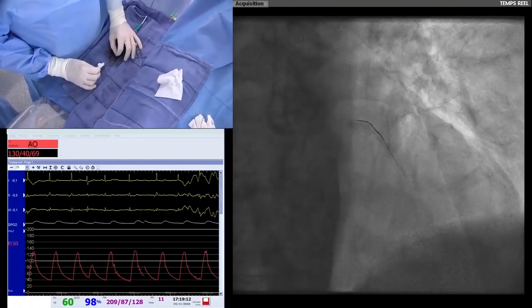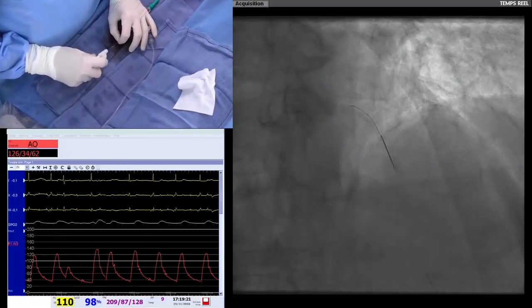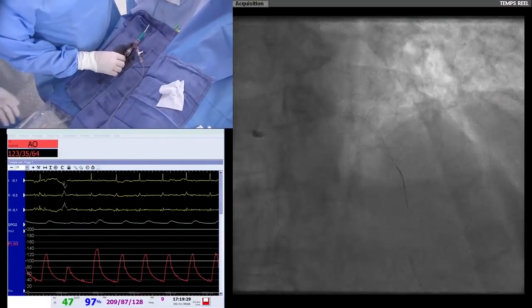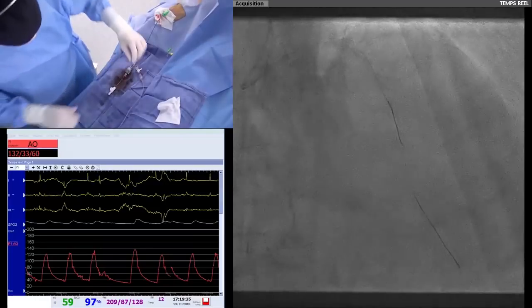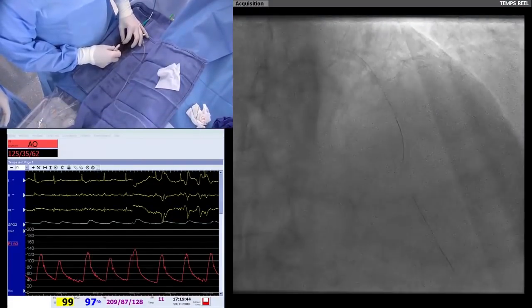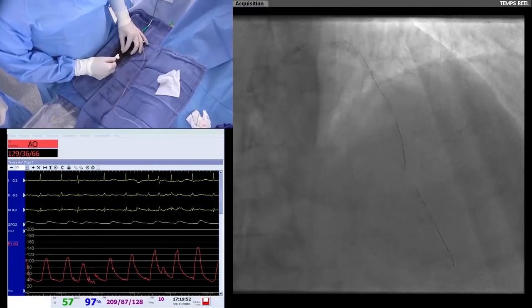Let me share with the colleagues the tips and tricks of Nicolas. Looking at the table from above, Nicolas is handling the ROTAWire with the use of the ROTAWire clip. To avoid buckling this long ROTAWire, Nicolas preferred to leave it within the plastic hose of the wire itself, which prevents the wire from being kinked. It's a 3-meter long wire and might easily fall off the table, but by doing so Nicolas has secured it. Of course, we pay a little price in terms of torqueability, but you see he's managing pretty well.